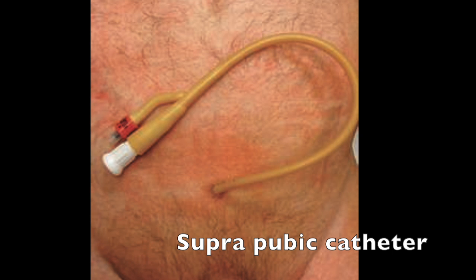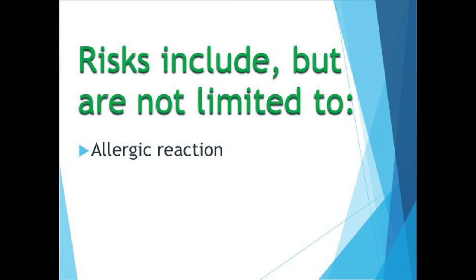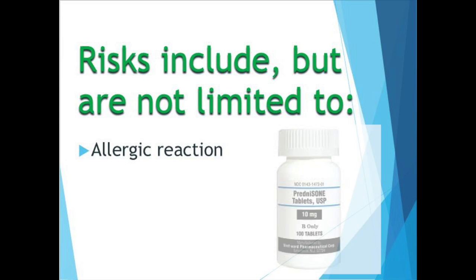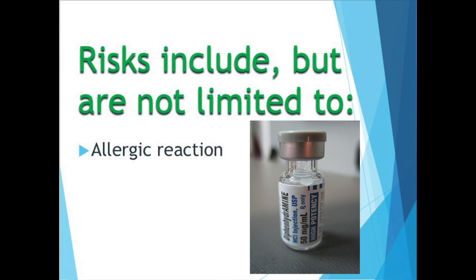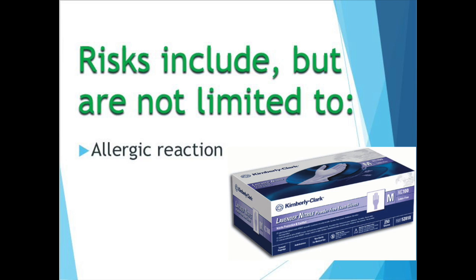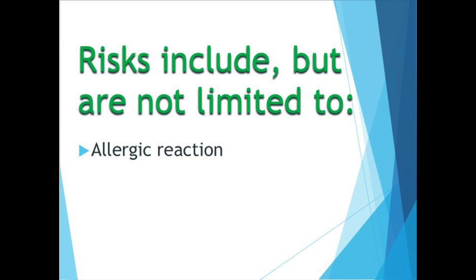Generally, no patient preparation is needed. Risks are minimal, as very few patients have allergic reactions to intravesical contrast. If a patient has had an anaphylactic reaction to intravenous contrast in the past, allergy prophylaxis should be considered. Latex precautions should also be observed, especially in those children with known latex allergies, multiple surgeries, or those with a diagnosis of myelomeningocele.